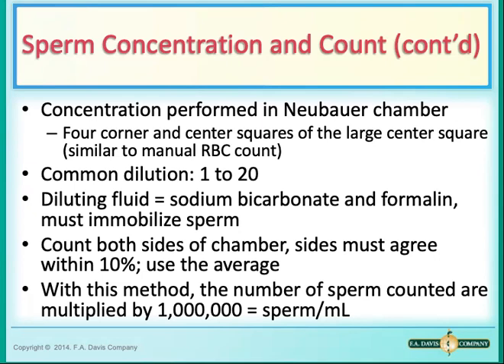We count only the fully developed sperm. Immature sperm and white blood cells, also known as round cells, are not included in your typical count. However, because the presence of white blood cells is significant, you can identify them and count them separately. Stains typically help us differentiate between immature sperm cells, or spermatids, and leukocytes, and they can be counted in the same manner as we count mature sperm.